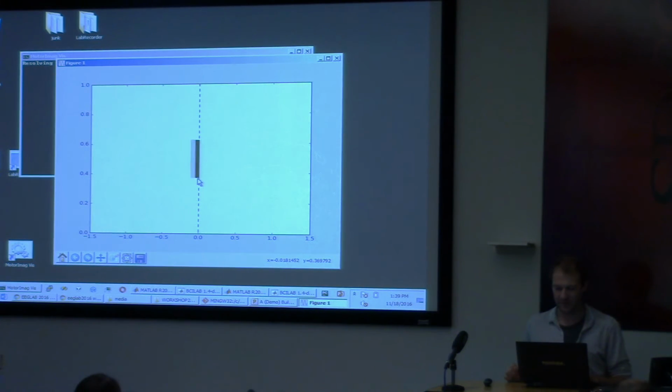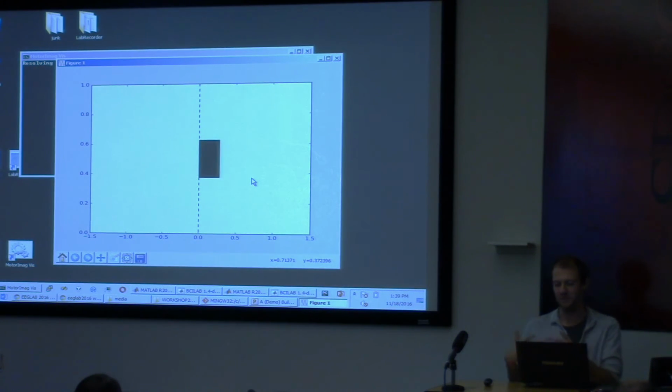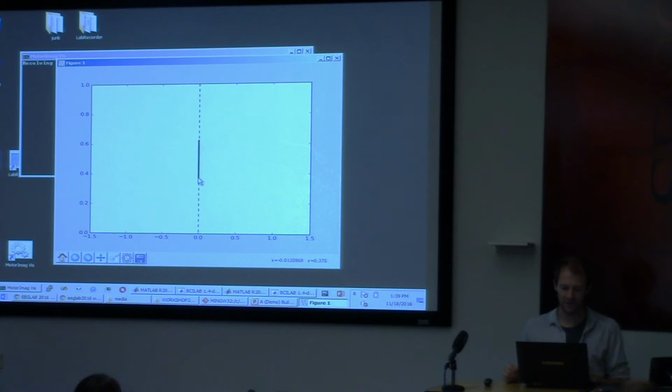When you follow this a bit, you basically kind of see what the pacing of that session is. Basically about every 5 seconds the person is asked to imagine a different kind of movement. It's a little jittery. Sometimes it's unsure, it's sort of in the middle. And so there's your BCI. So that was pretty quick to start.